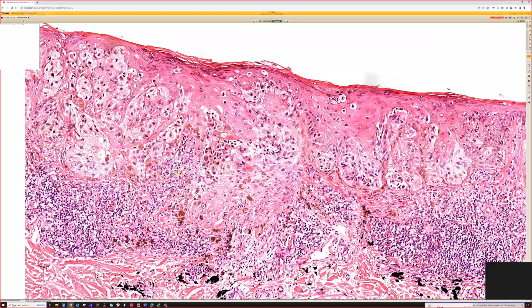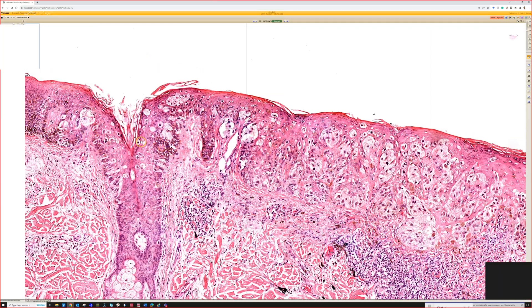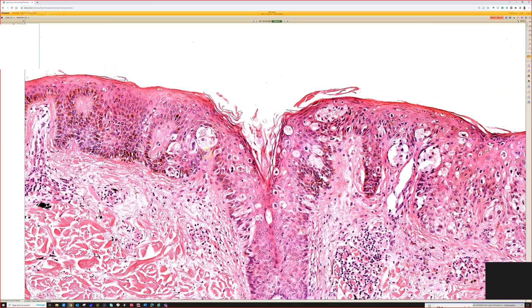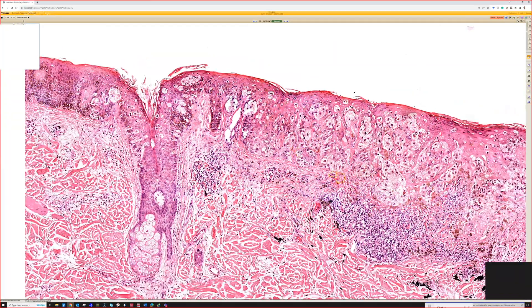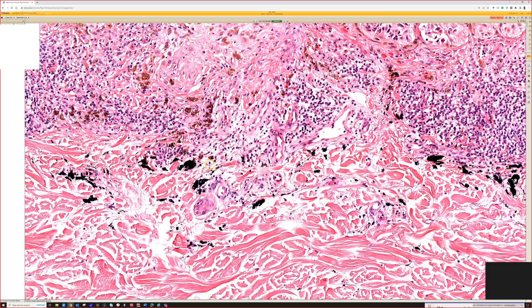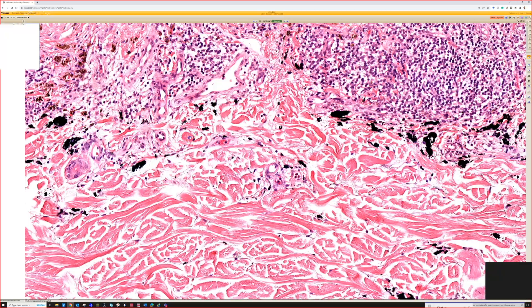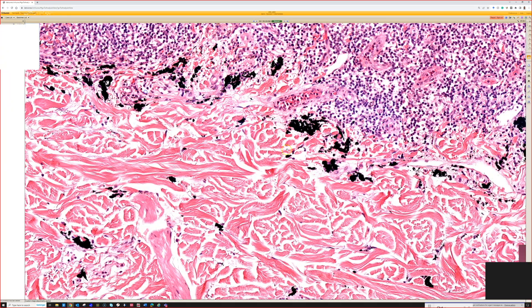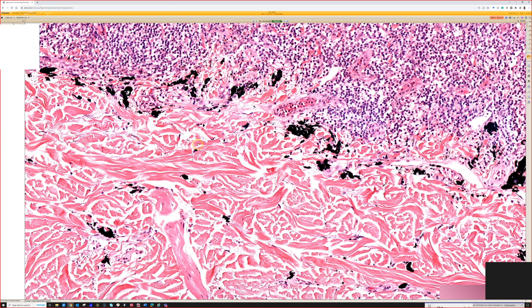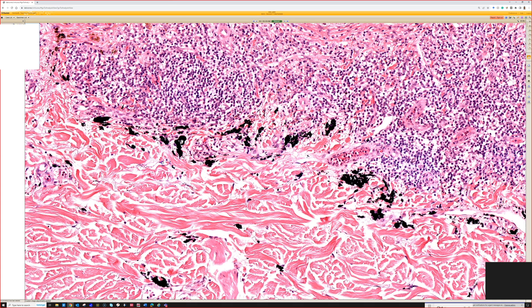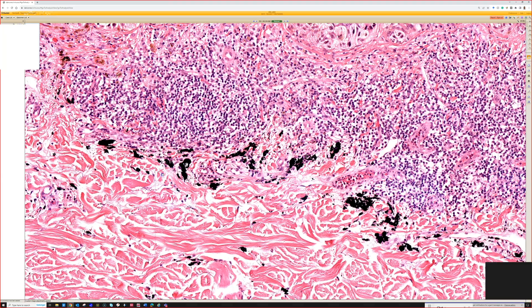Lots of pagetoid spread, lots of atypia — very straightforward, kind of puffy, almost ballooned-looking melanocytes in this case. And then a bonus finding: we've got this black pigment. If you're just starting out in dermatopathology, you might say it's melanin — but no. Melanin is not black. Black is always exogenous; the human body does not make black pigment.